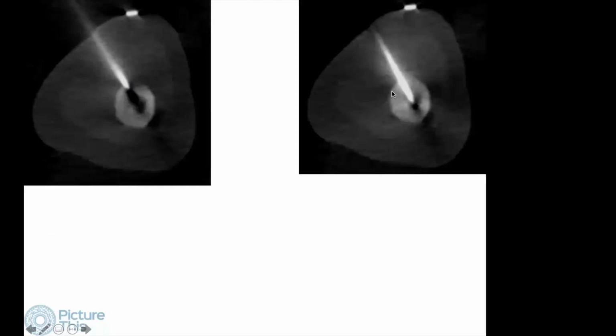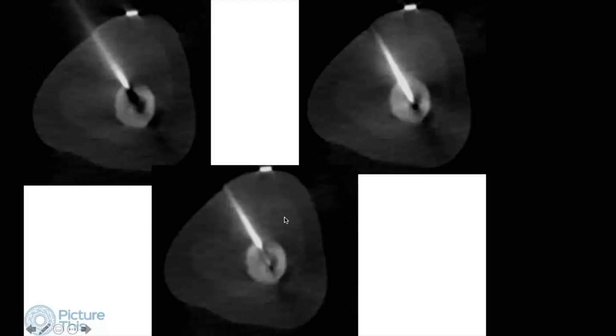So here we are using the 11 gauge needle to drill into the bone. And now we've done the drilling. And then all I have to do is push in the electrode directly. The electrode, since it's using impedance, it can go through a non-shielded needle as well. All we have to do is make sure that it's positioned across the osteoma, and then we would burn it.